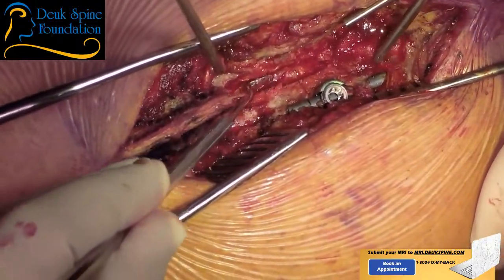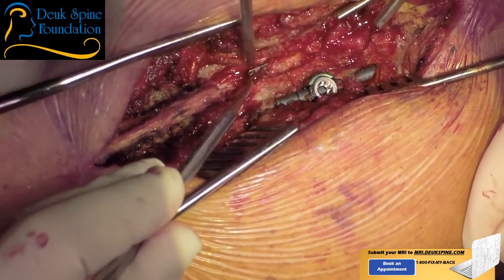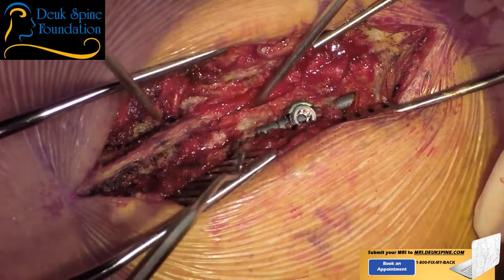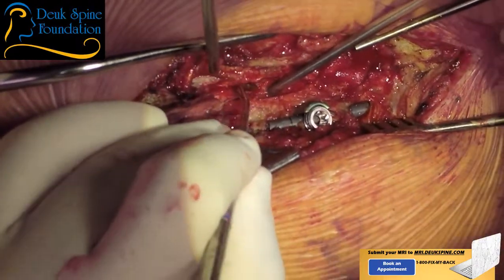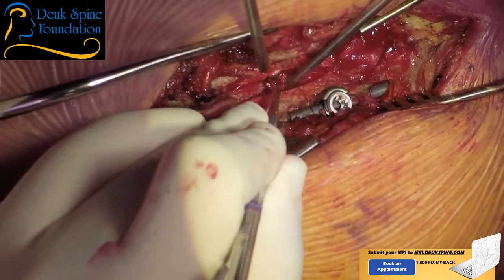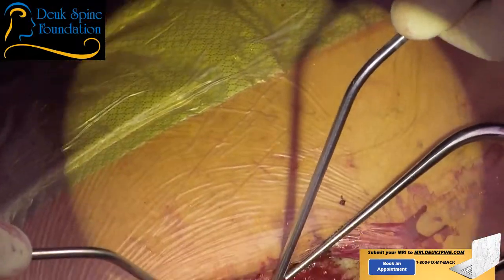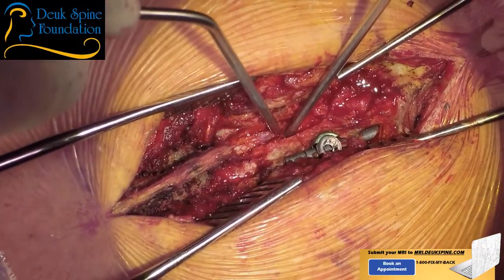And you can see the spinal cord down there. It's been decompressed. Let me see you, Dr. Pateau. So now we got the fun issue of scarring of the spinal cord to the bone, which we don't want, obviously, because that makes it a lot harder to take this out. I need a straight curette, actually an angled curette. Yes, sir. Small. No down pressure.